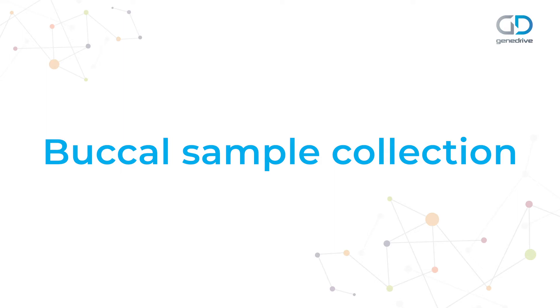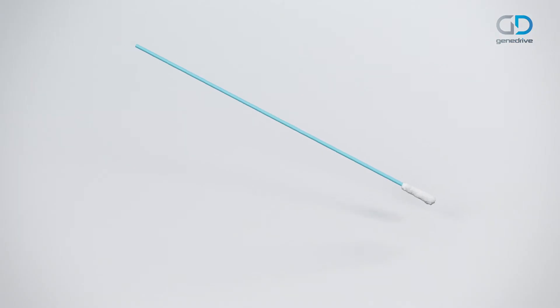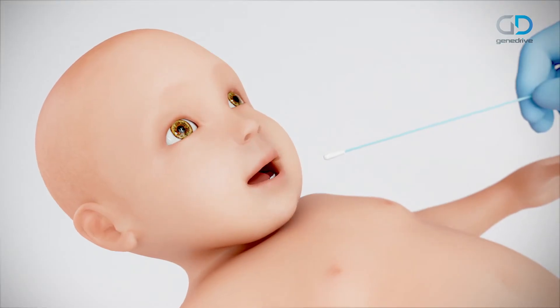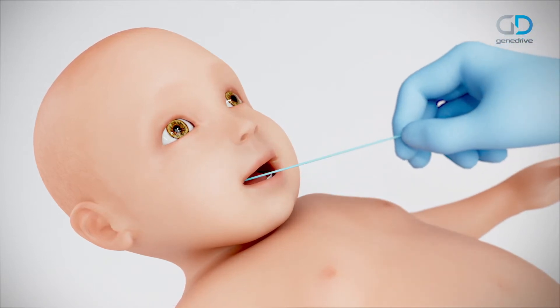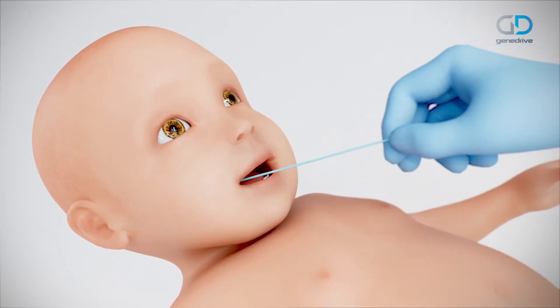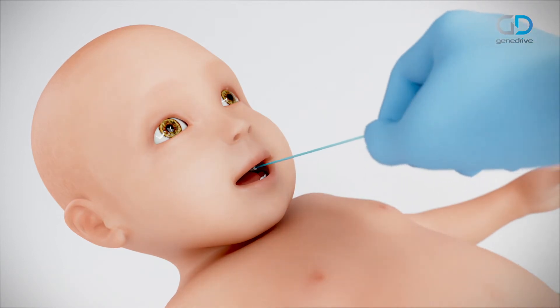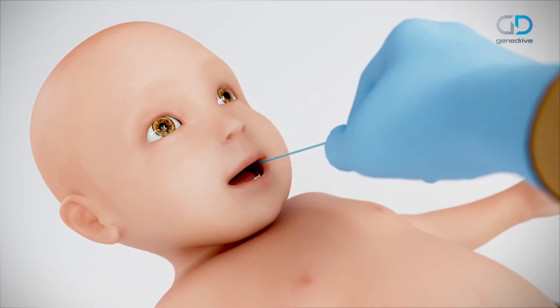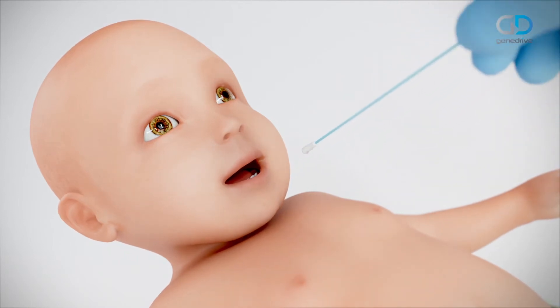Start with buccal sample collection. Open the GeneDrive MT-RNR1 ID Kit and remove the buccal swab pack. For neonates, rub the flat part of the swab across the inner cheek in a forward-backward motion for two strokes, then repeat using the other side of the swab on the opposite cheek for a further two strokes. For adults, use a total of 10 strokes on each cheek.